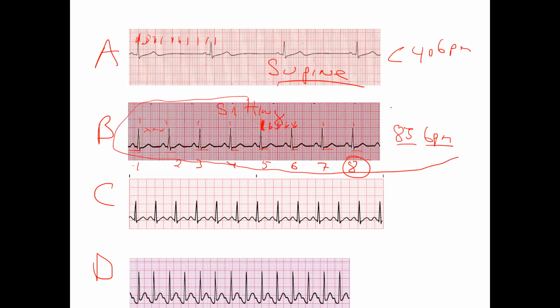Yeah. And it'll tell you on the EKG machine, but it's important that we learn how to do this. Sometimes you have to figure it out quickly, and it doesn't tell you. The next one would be Emily standing.